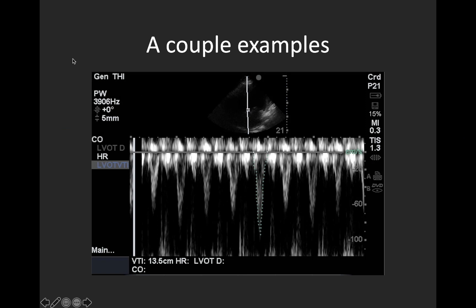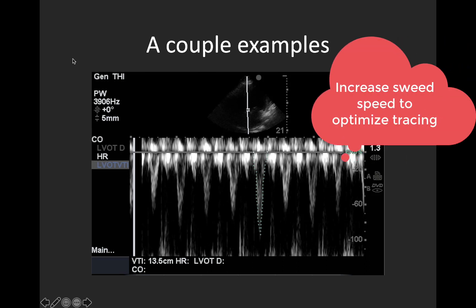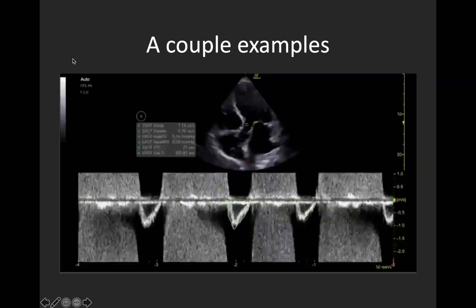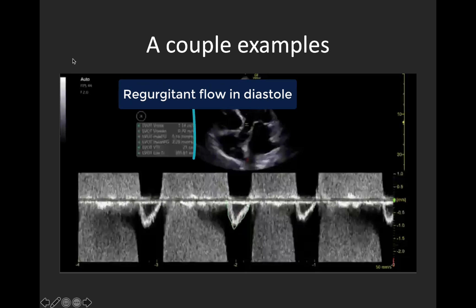Here is an example with a reasonable trace from a difficult 2D image, though to optimally measure this we might have increased sweep speed to stretch the waveforms more across the screen and make tracing easier. There is also some beat-to-beat variation, perhaps with respiration, so ideally we would measure several beats and average them. And this is a pretty stunning example showing what aortic regurgitation looks like on this image — since you're in the LVOT you'll capture regurgitant flow through the aortic valve if present, seen here as flow above the baseline that has aliased completely, generating an impressive waveform pattern.